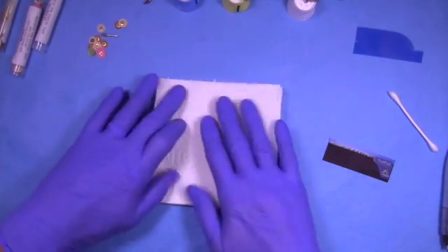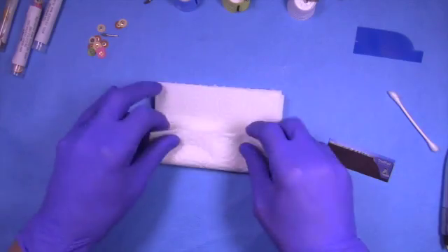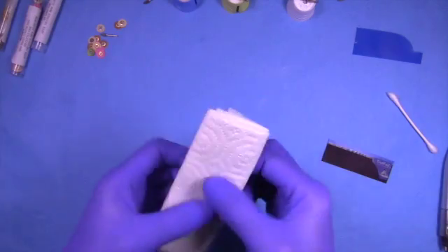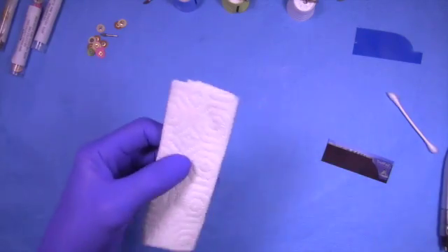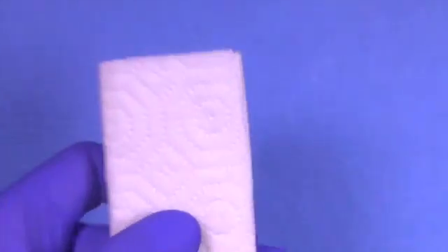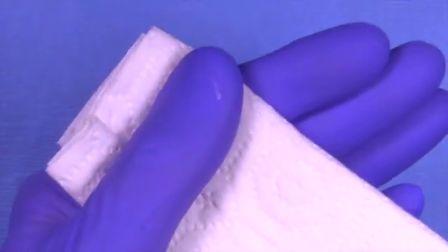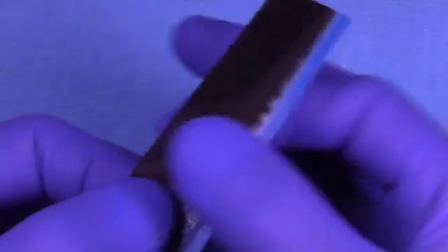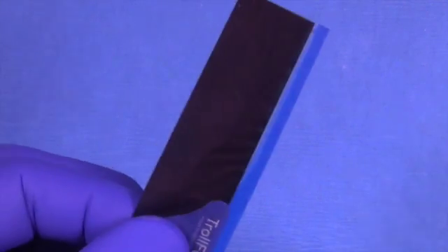Sometimes to get things to mark well you need to dry off the teeth. When we're finished with the castings and we've taken off the rubber dam, you can fold up a paper towel like this and just have the patient bite down into this towel. You will soak up any slippery stuff off the teeth, whatever that is.